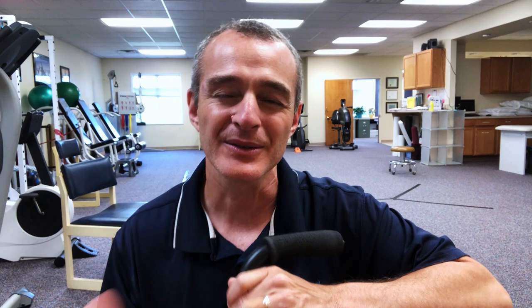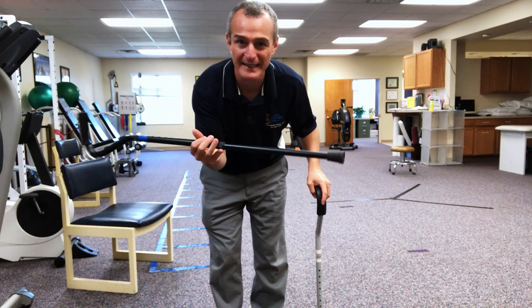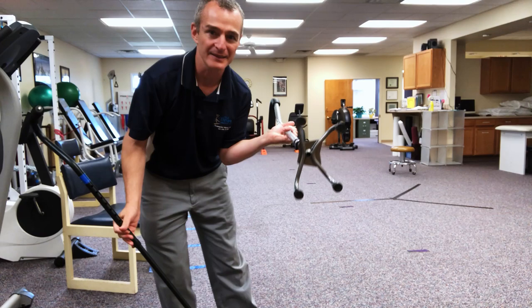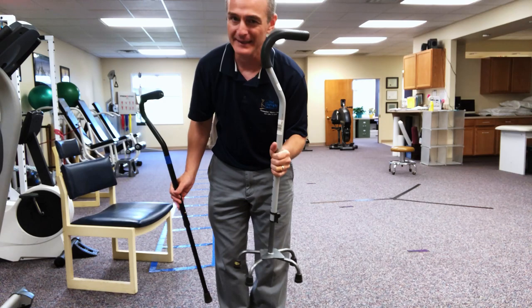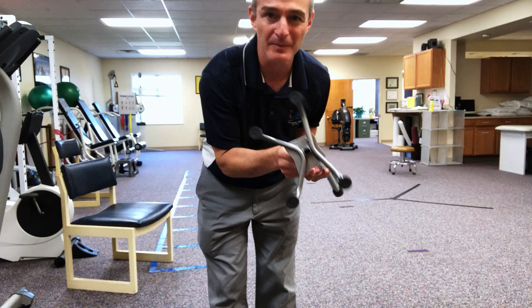I've got two canes here today. This one is called a straight single-point cane — it's got a normal bottom. Then we've got a quad cane with four little prongs at the bottom. Most people are not going to use the quad cane; it's a little heavy and clunky. I want to give you a quick intro to it, and probably the most important part of the quad cane is the bottom.